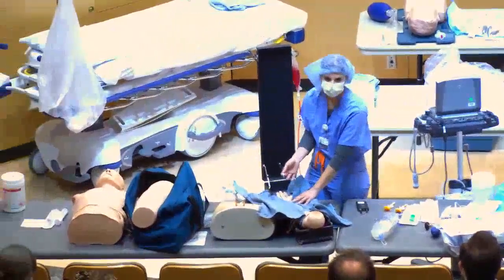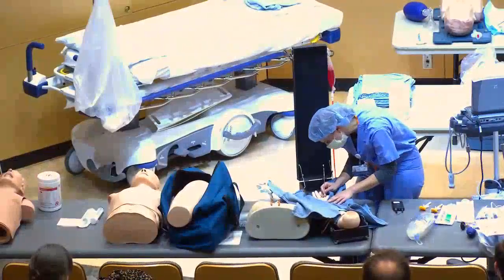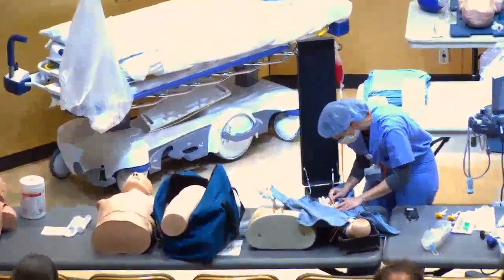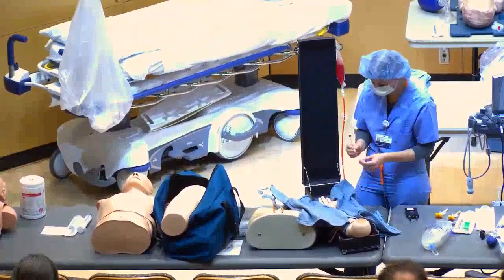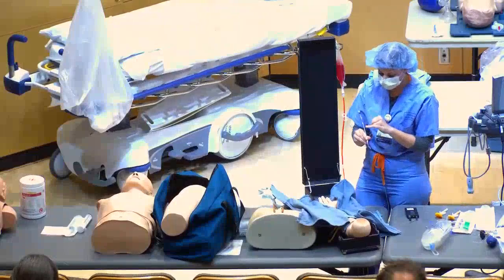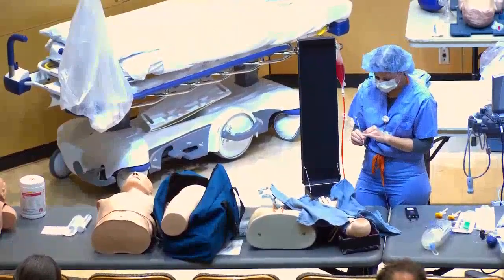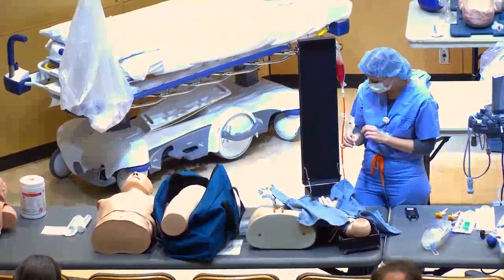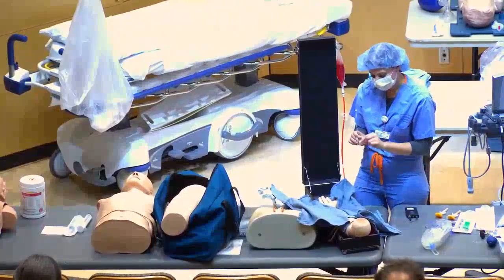Go in at about a 45-degree angle; raise your table so you're not hunched over. If the patient is awake, give a little lidocaine — just a small wheal. Once you get flash, you want to see the blood climb up the catheter — good flow means it climbs nicely. If your angle is off, you can drop the angle once you're in to ensure you haven't gone through-and-through. Once in with good flow, pass the wire, then pass the catheter over it.